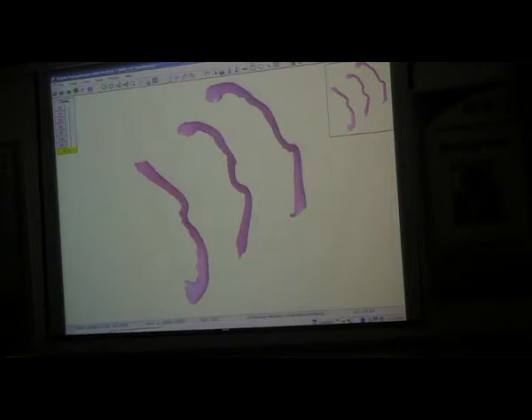So someone asked me to do a cornea, and here is the H&E of the cornea. It's a lovely case. And let me find a good spot here for you.